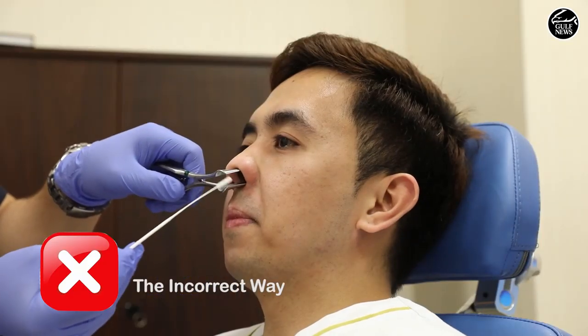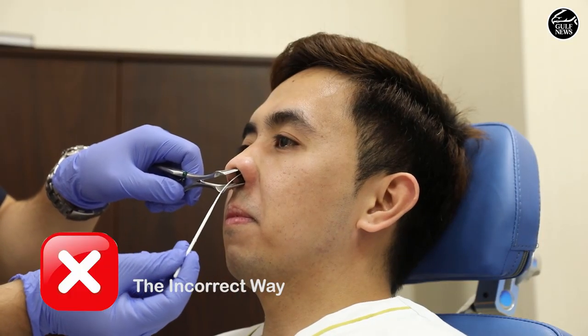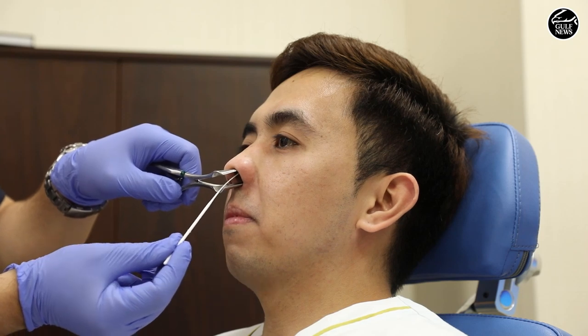If you go in and then go this way up — for example, like this improper way — if I go like this up, it's improper. It's not good. Therefore, the direction is all the way to the back.